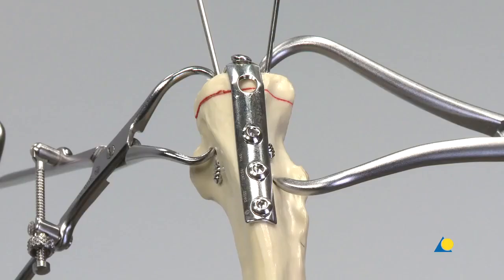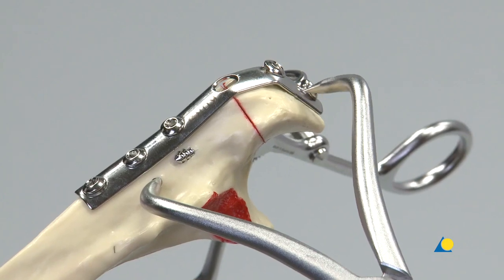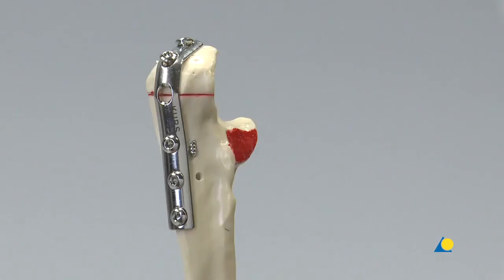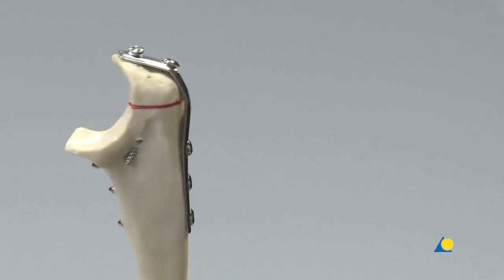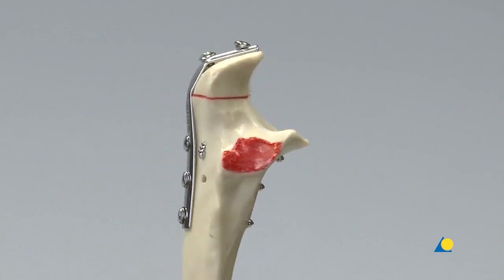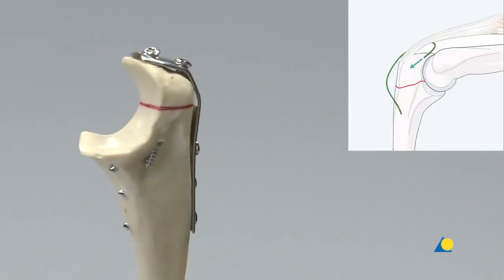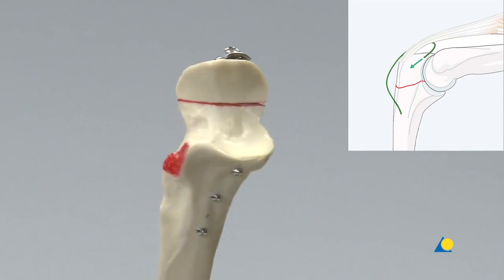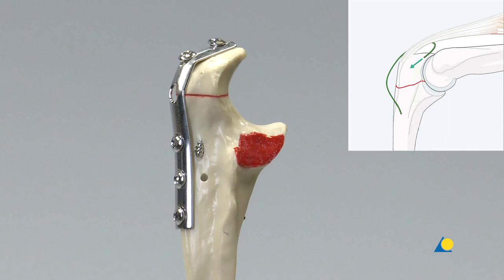The osteosynthesis is completed by inserting screws in the remaining distal plate holes. The K-wires and the forceps are now removed. As this plate works as a tension band plate, it is mandatory to fix the small proximal fragment and the triceps tendon with a circular suture to the third plate hole or around the head of one of the screws.